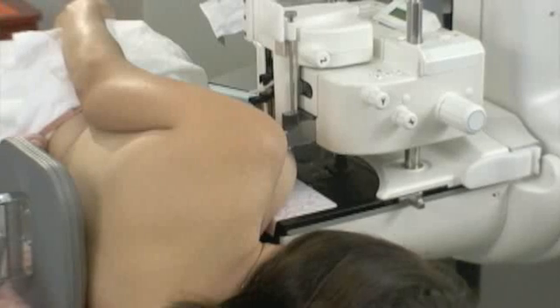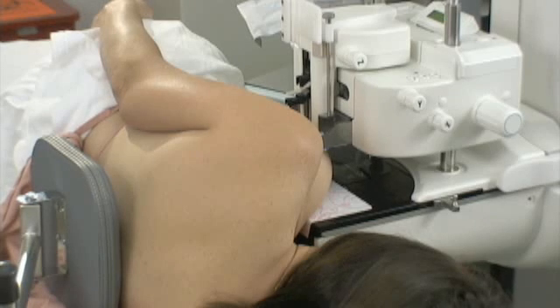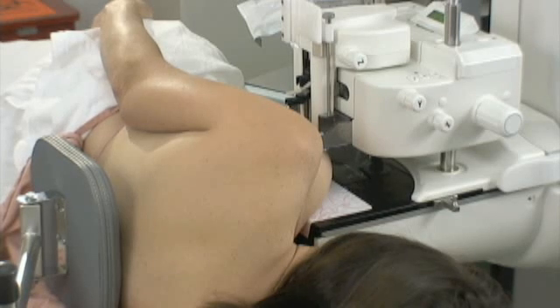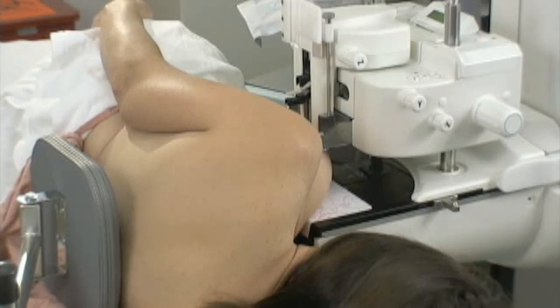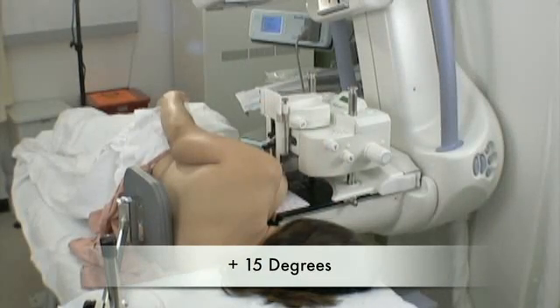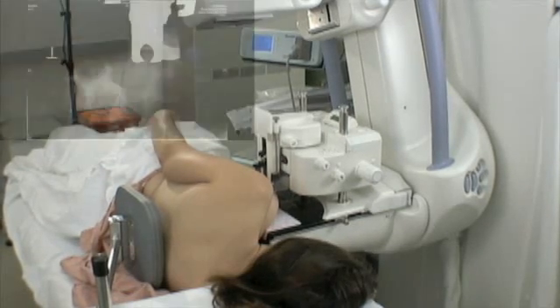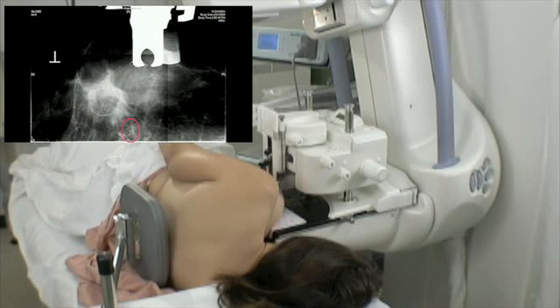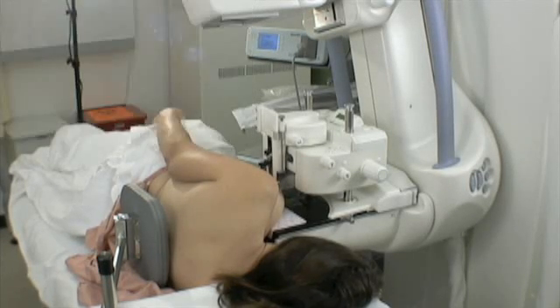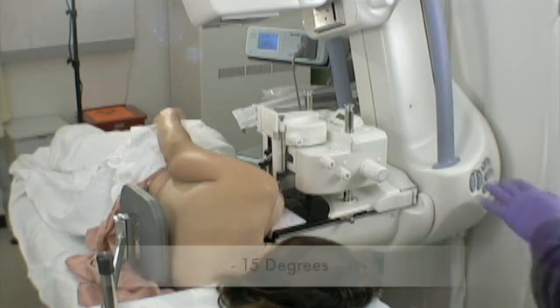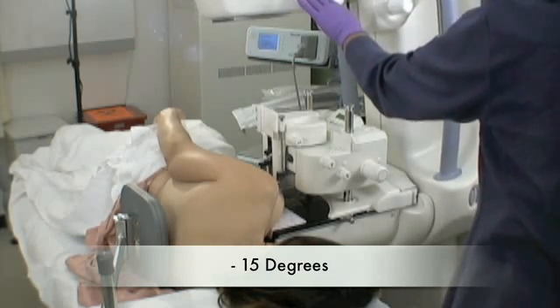We are now going to bring up the scout image. The calcifications are right in the center of the biopsy window, and in a moment we'll prepare our stereotactic views. We have angled the gantry plus 15 degrees off the central axis for the first stereo image. As soon as this image comes up on the monitor and we like it — looks beautiful — we will angle the gantry minus 15 degrees for the second stereo image.